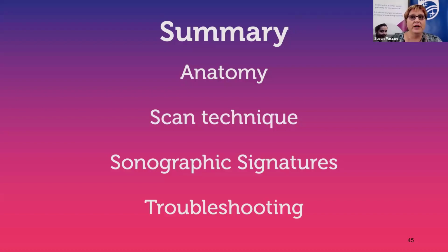I'm going to point out again that I think the biggest mistake that can be made in the emergency room in particular is the gain setting. So make sure you have a look at the echogenicity of the kidney against the liver. Does the liver look really bright white? Well, you've probably got everything a little bit too high. So just make sure you've got nice, even grey gain settings across the whole field and not too bright.